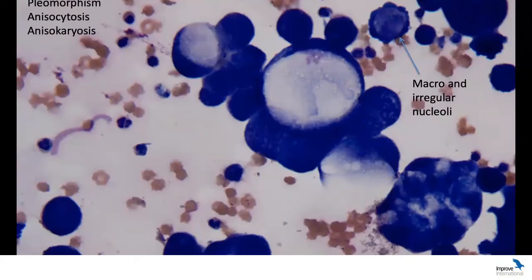Now, I also want you to think about the size of these neoplastic cells. Some of these cells were huge. Again, if we compare this cell against the neutrophil here, we can say that this is indeed a cell that has karyomegaly. So it's got cytomegaly and karyomegaly: really big cells, and a really big nucleus as well.